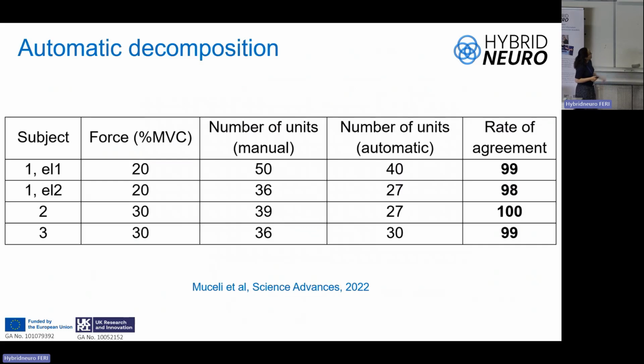Again, this slide is similar to the one you have seen before. Here we have units detected manually. I processed the signals, and Aleš, you didn't know my results, decomposed the signal automatically with the CKC algorithm. You can see now that in this case we are able to detect 75% of the units, not 30% as in the past.